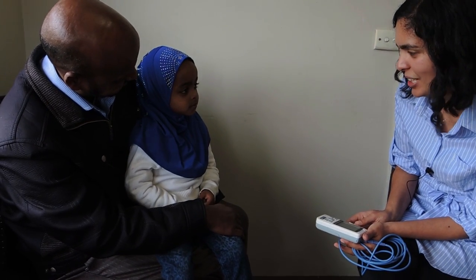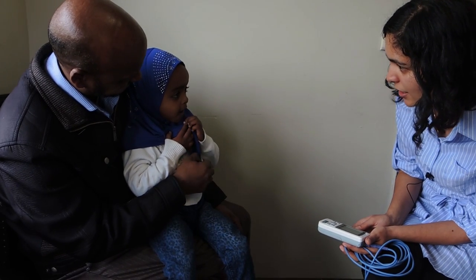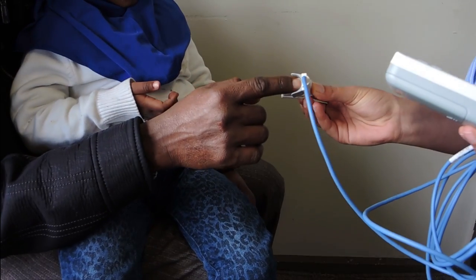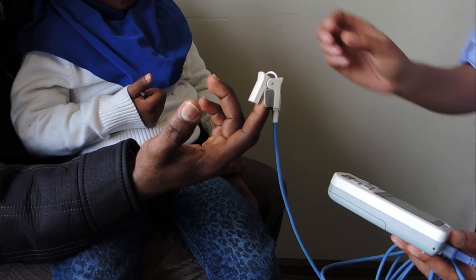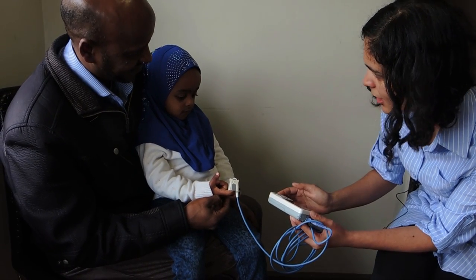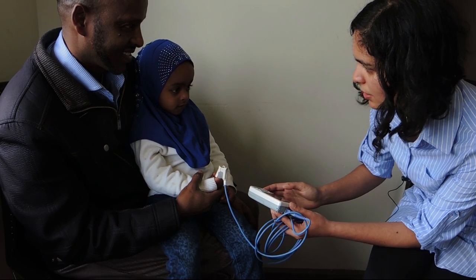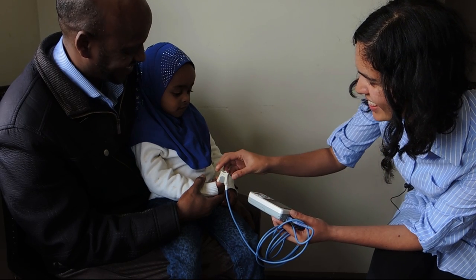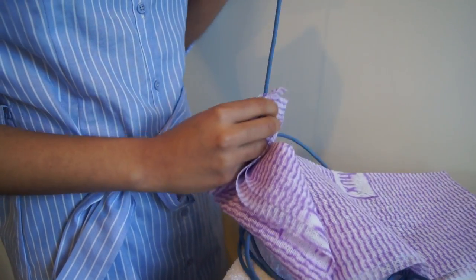How to use a pulse oximeter. Kabale is a two-year-old girl who has come to hospital with her father. Dr. Mariam is going to check her oxygen saturation. Dr. Mariam introduces herself and explains she will check the oxygen levels. She first demonstrates the device on the father, getting a reading of 99%. Then she tries on Kabale's finger, initially getting a poor trace, so she tries a different finger and obtains a reading of 100%.